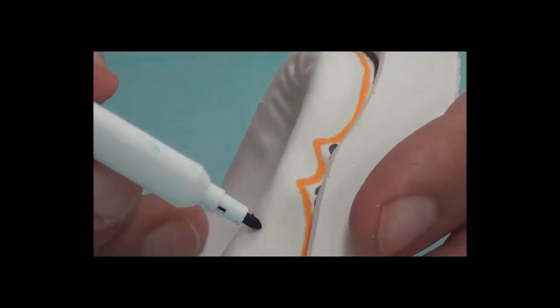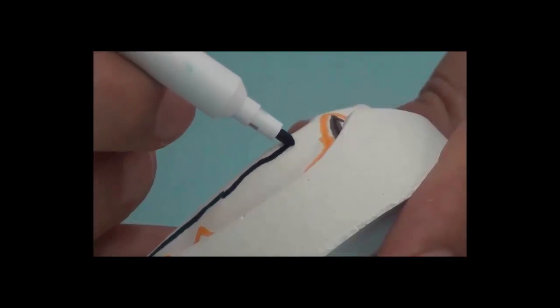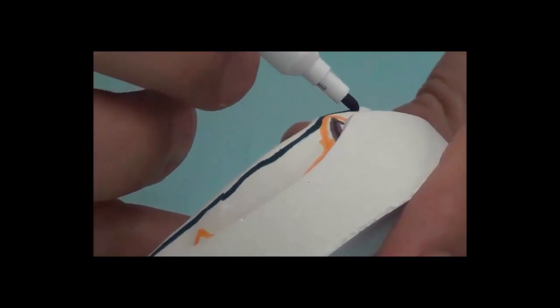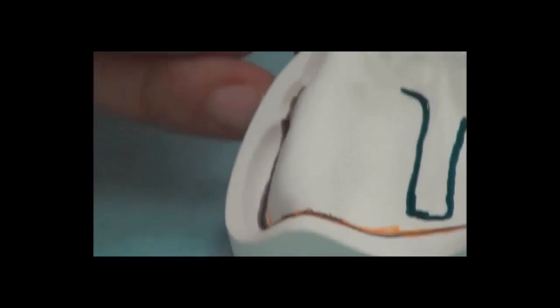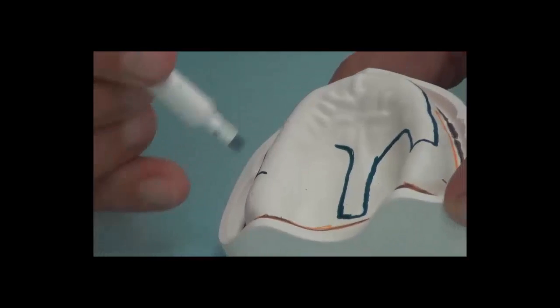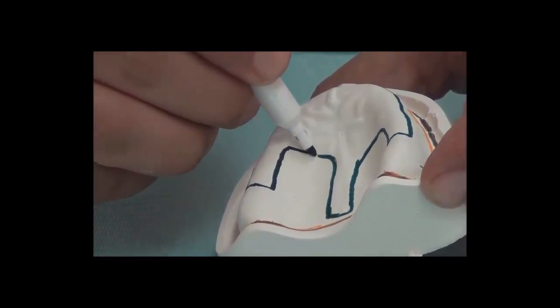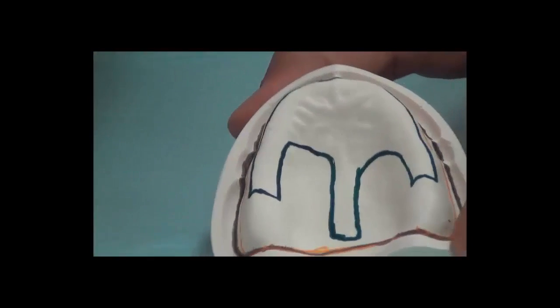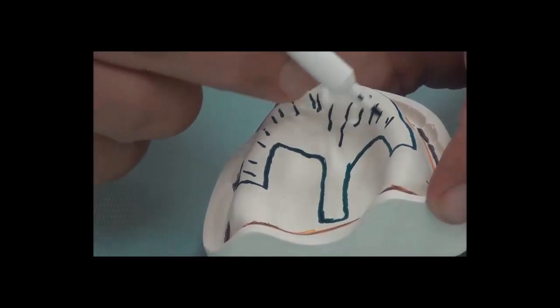The crest of the ridge is over and away from the tray border. So the crest of the ridge, the incisive area, the rugae area are included inside these lines. We go all the way to the other side, exclude the tuberosity, and this is our relief area.